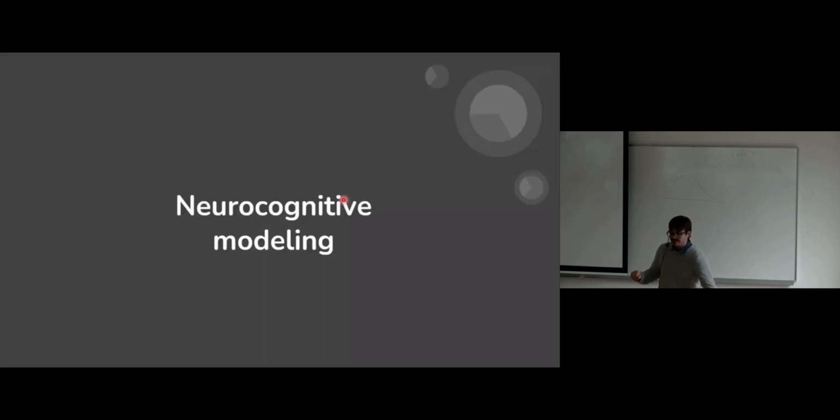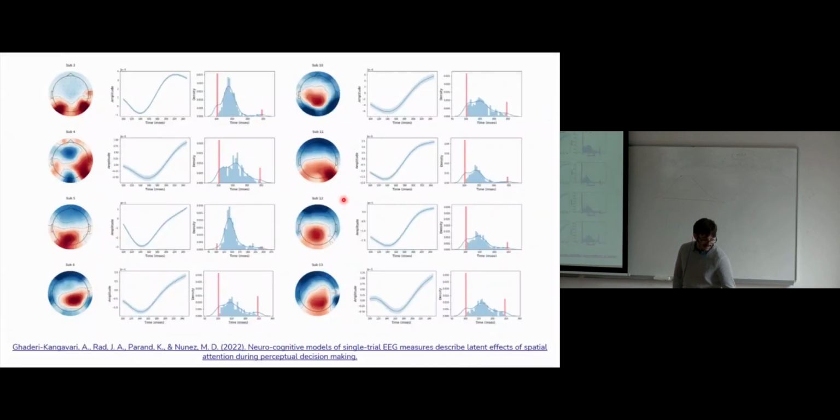Regarding simple decomposition, did you compare it to a super simple decomposition where you drag a box around those central electrodes, in let's say the damped sinusoid? If you drew a box, these weights are optimally found to be descriptive of the ERP average, so drawing a box would be worse on a theoretical level. But if you averaged a few electrodes together and found the right electrodes, it would definitely be better than looking at single electrodes.